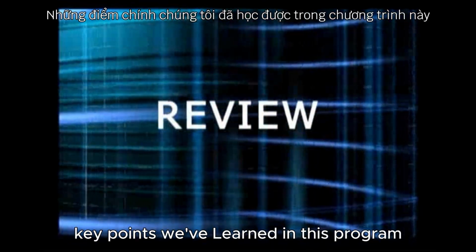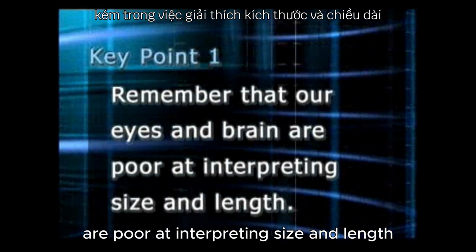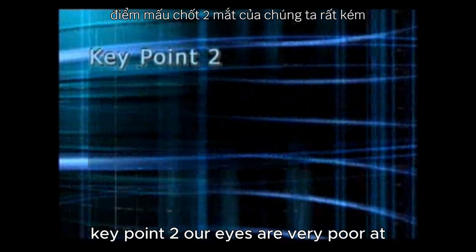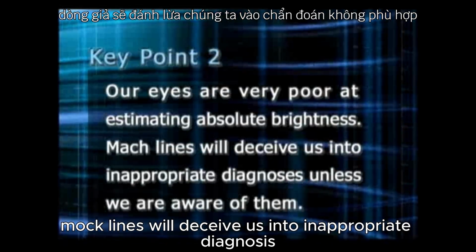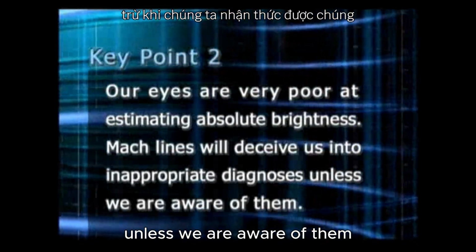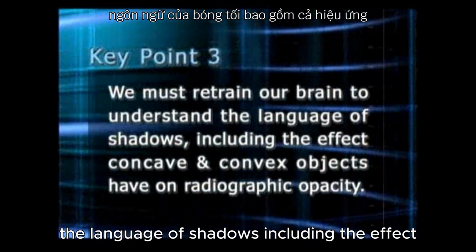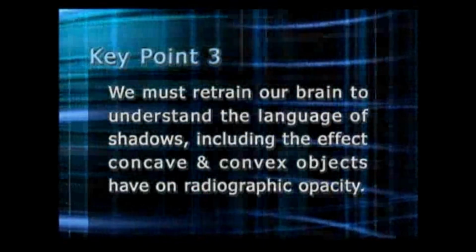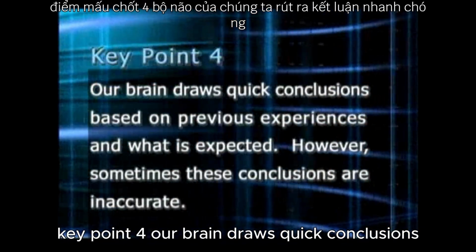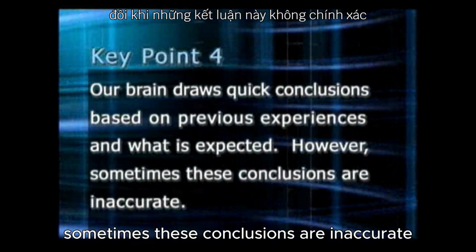If the pulmonary veins are larger than the arteries, and if there is a left atrial enlargement, heart disease is very likely. Let's review the 7 key points we've learned in this program. Key point 1. Always remember that our eyes and brain are poor at interpreting size and length. Key point 2. Our eyes are very poor at estimating absolute brightness. Mach lines will deceive us into inappropriate diagnoses unless we are aware of them. Key point 3. We must retrain our brain to understand the language of shadows, including the effect concave and convex objects have on radiographic opacity. Key point 4. Our brain draws quick conclusions based on previous experiences and what is expected. Sometimes these conclusions are inaccurate.